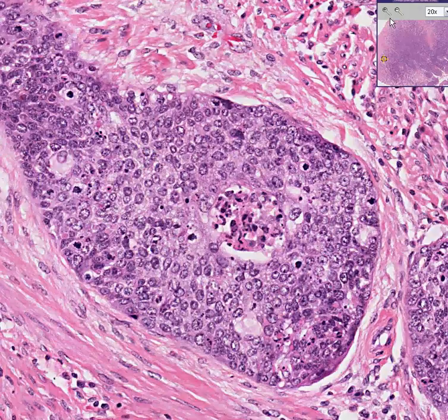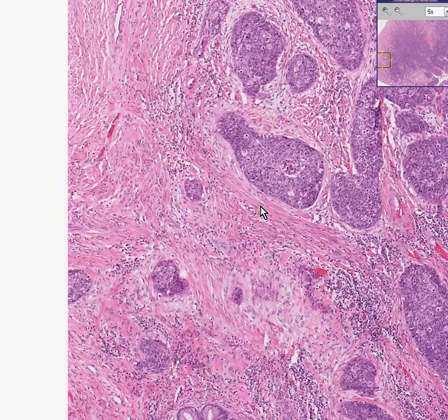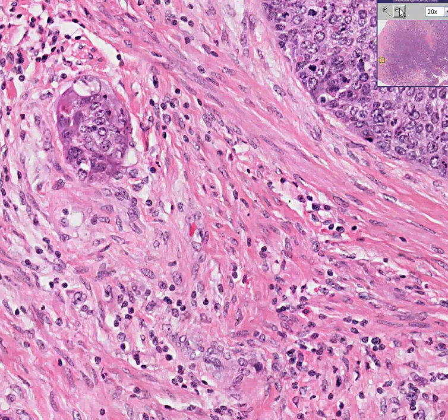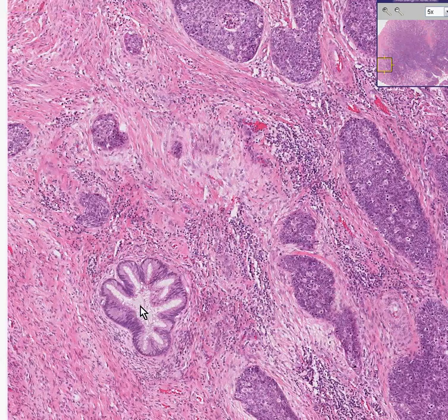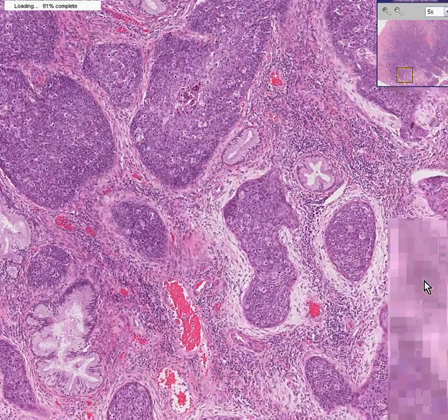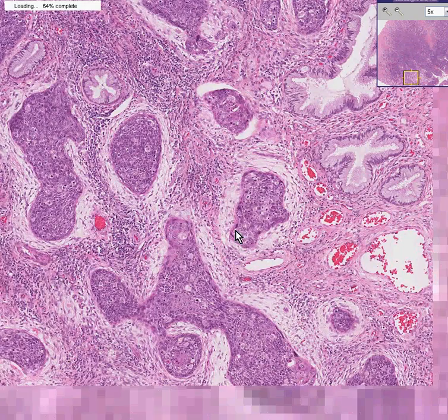You know it doesn't look very squamous at all, so you would not call it well differentiated, maybe moderate or poor. Notice how it very irregularly, haphazardly infiltrates through this fibrous connective tissue here, because these are all fibroblasts and collagen, isn't it? Notice how it is next to some normal looking endocervical glands. And notice that here's some more normal glands, tumor, tumor, tumor, normal glands, normal glands. Notice it's not an adenocarcinoma.